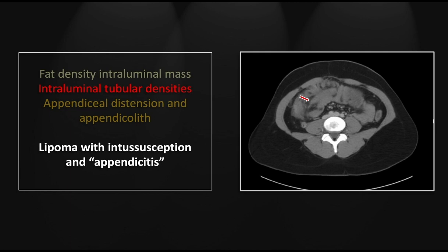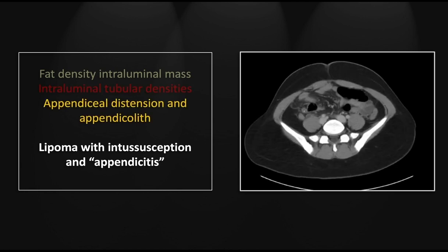Due to the intussusception, there has been obstruction of the appendix, which has become inflamed. There is a small appendicolith, there is distension, and there is wall thickening. These meet all the criteria for acute appendicitis, although upon viewing the cine, you may suspect it is mechanical.